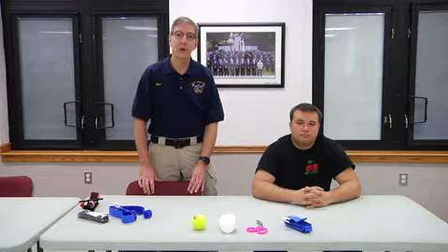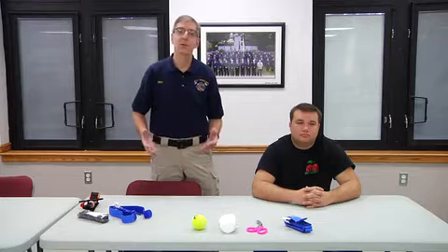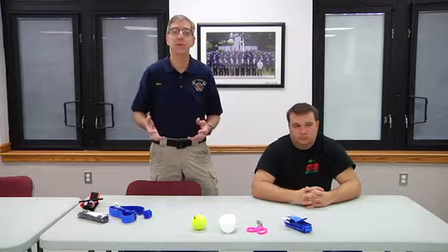I'm Mike McEvoy. I'm going to talk about a drill today for self-application of a tourniquet. You can think about some situations where you may need to apply a tourniquet to yourself, and practicing that is probably a skill that we don't often consider. So, 4 things we need to do this drill.